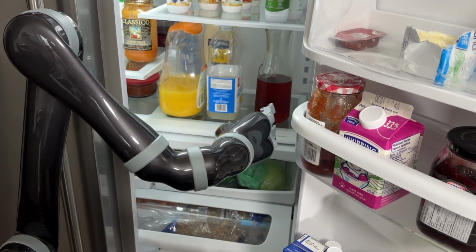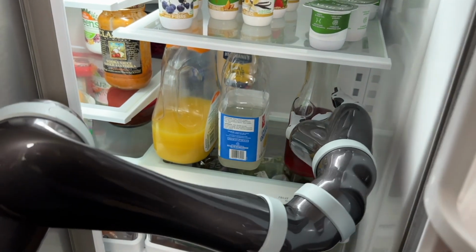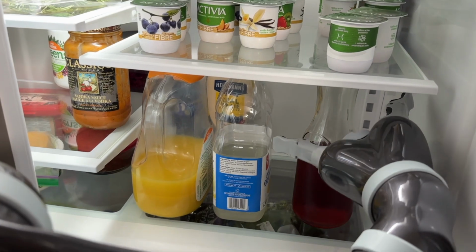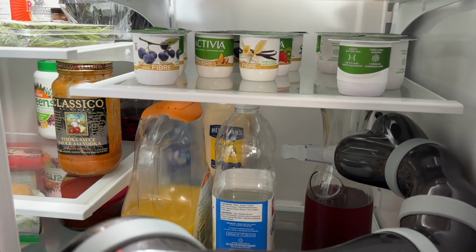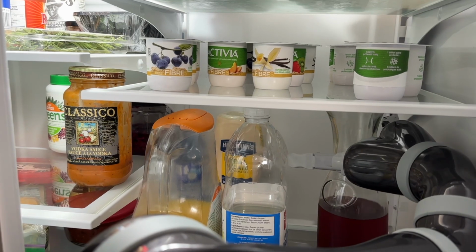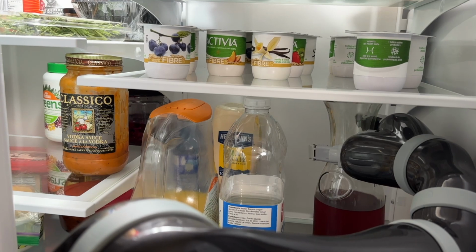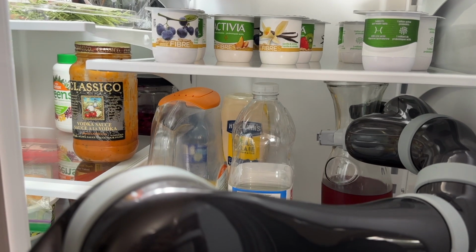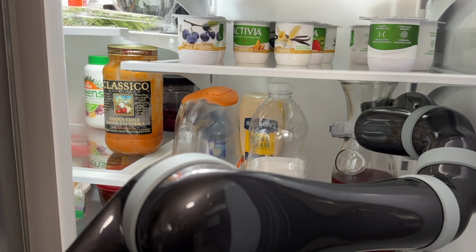So we're trying to grab this glass bottle in here full of red herbal tea. So I'm going to open up Jaco's fingers as wide as they'll go and get closer. It's important whenever you're picking up something to ensure that it's in Jaco's palm as deep as it will go. So here I know that I've hit with Jaco's palm, and now I'm going to grab the fingers as tight as they'll go so that we've got a secure grip. And now this space is a bit tight, so I'm going to give it a slight lift, and then I'm going to begin pulling it out.